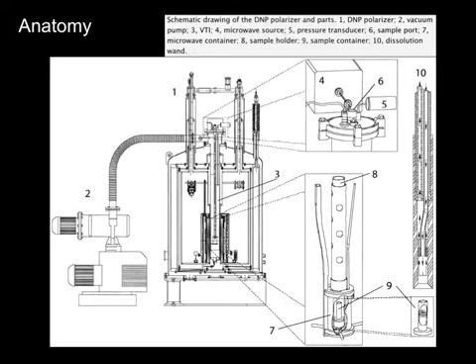Let's see, what else we got here. The dissolution system is partially shown here. So the bomb that sits up above everything is not shown here, but that's where you'd put your solvent in, and that would get heated up, and then it would shoot down into the sample when you're ready to dissolve it, and that occurs through what's called the dissolution wand or dissolution stick, and this is what links the DNP system to the dissolution system.